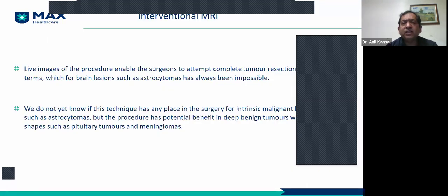Next is interventional MRI, intraoperative MRI. In the pre-op we can first localize by the functional MRI. We localize which part of the brain is what, we can mark that, and we can avoid it during the surgery. Next is intraoperative. In this, we remove the tumors, and if we have a brain suite, then we can do intraoperative MRI, and see if any tumor is left or not, or we can remove it.